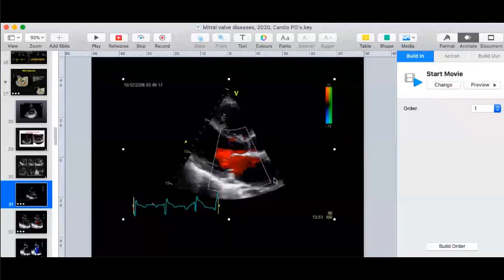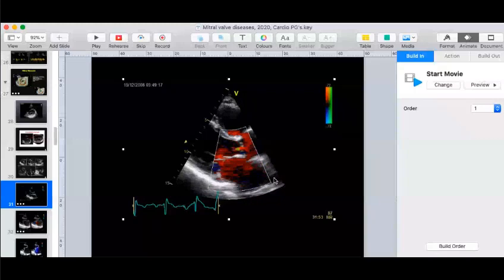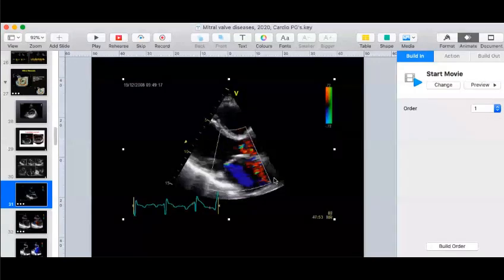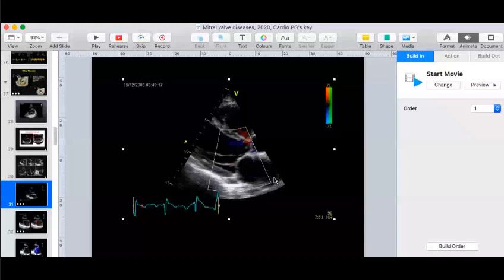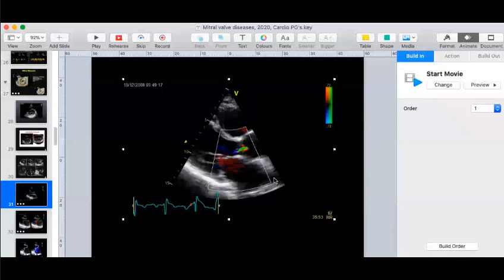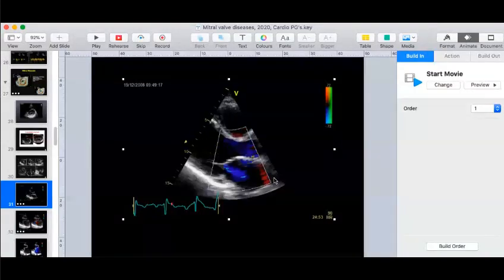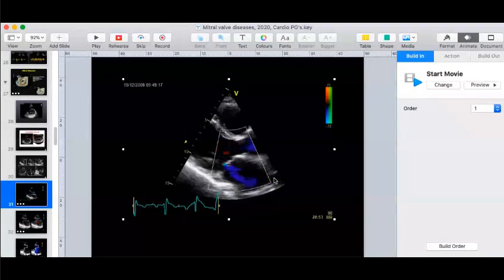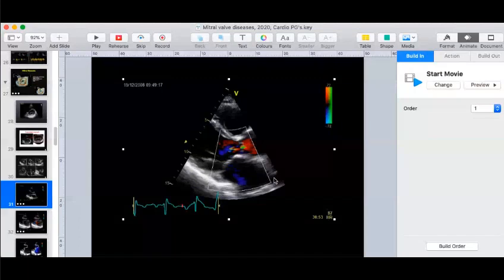No, I wouldn't talk about the segments. I'm talking about the mitral apparatus. Is it at the leaflet level? Is it at the annular level? Annular level, sir. We can see the contractility is less, so I think it's more due to annular dilatation. Is it, sir? So the message here is that if you see a centrally directed jet, always think possibly it is an annular dilatation.